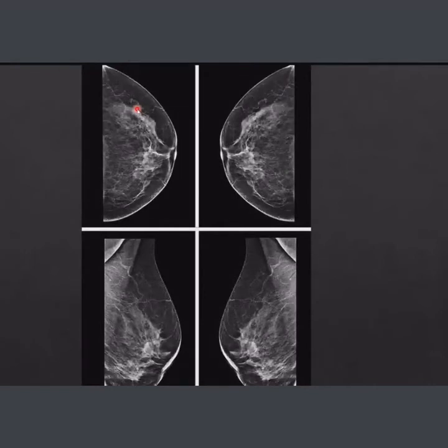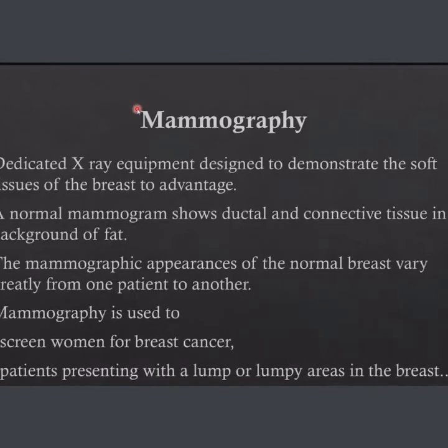As we said, in the world we start the assessment for screening with mammography, and if we see any mammographic abnormality we do a focused ultrasound. The situation in our country is reversed and wrong, hopefully you will correct it in the future. Any patient with suspicion, any patient for screening, is sent for ultrasound, which is wrong. Ultrasound is not sensitive. Ultrasound will also detect a lot of benign pathologies that will lead the patient to have a lot of biopsies.